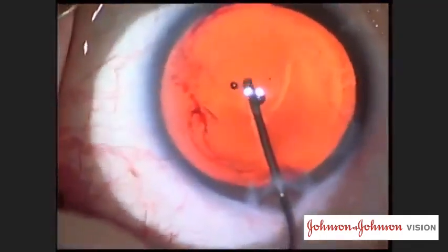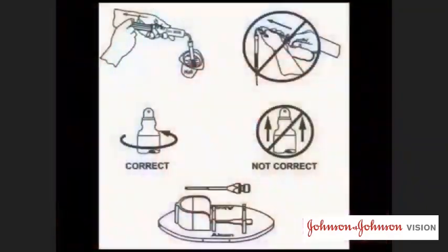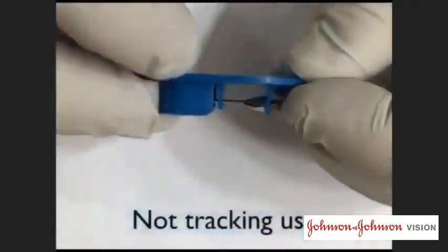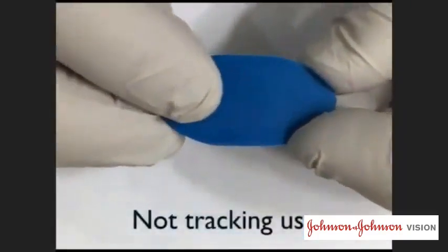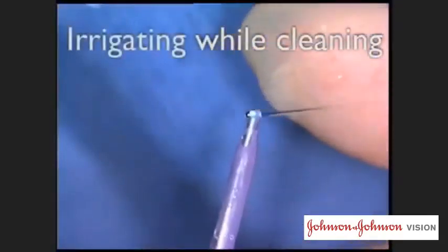I contacted Alcon, the manufacturer of the IA tips. They recommended investigating how the tips were cared for. To my dismay, our surgical center deviated from the manufacturer's recommendations. Was this the cause of our problem?